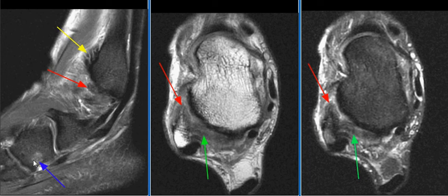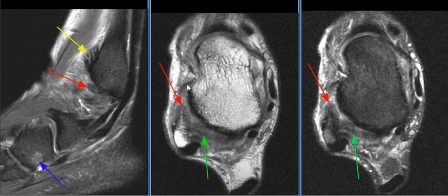There is possible stress-related edema in the distal lateral aspect of the cuboid bone, as seen on this sagittal image with this blue arrow. MR findings are consistent with a complete tear of the anterior talofibular ligament and high-grade sprain of the posterior talofibular ligament.